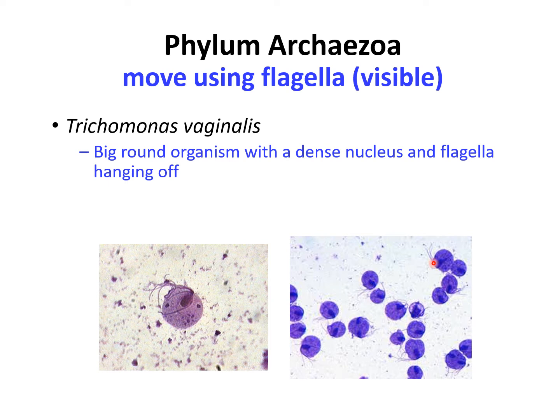So this is how they would look under the microscope, and it would cause vaginitis, so inflammation of the vagina, and definitely those are pathogenic, okay, so they are going to cause an infection, and they're going to lead to symptoms.